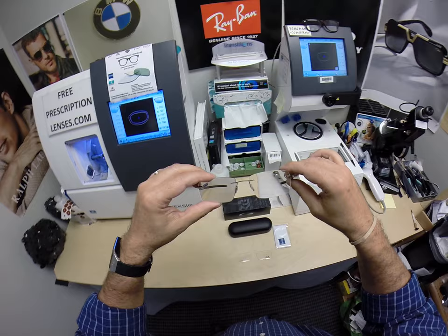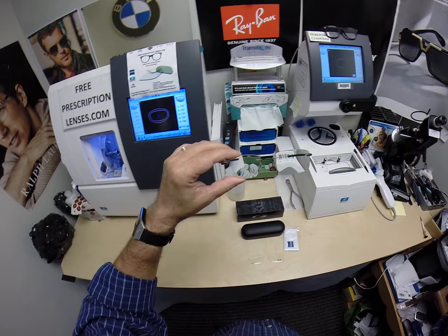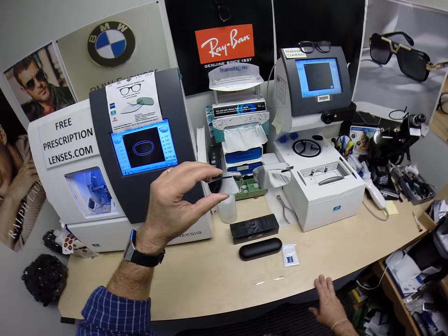Now these have the Zeiss Lite-D digital freeform progressive lenses with the Photofusion Gray EnduraVision chrome anti-glare, but I can do any prescription. I can do single vision, I can do the line-style bifocal, I can do the invisible bifocal as shown here.